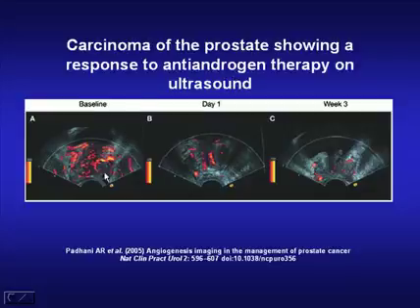Here is a simple power Doppler study of the prostate, enhanced by contrast to give us better visualization of the degree of vasculature. After several weeks of anti-androgen therapy, you can see that the vasculature declines dramatically, and a switching off of blood flow through the malignant areas is a characteristic feature of successful treatment of prostate cancer.